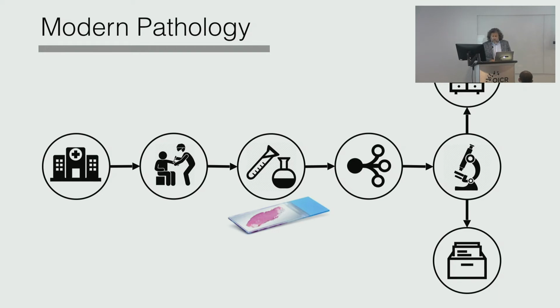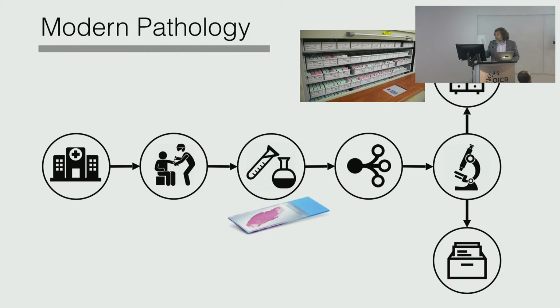And that piece of glass slide will go and get archived. Different countries have different rules, but basically we have to keep them for many, many years. The patient may come back, we have the block, we can make another cut and take a look at it. Also, not just for the patient record, but probably for research. Although, to my knowledge, when the glass slides go to those large archives in the basement of the hospitals, they are usually not touched anymore. So they stay there, and most of the time nobody does anything with them.